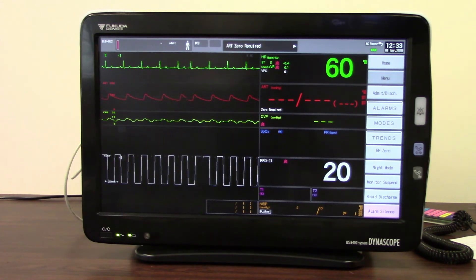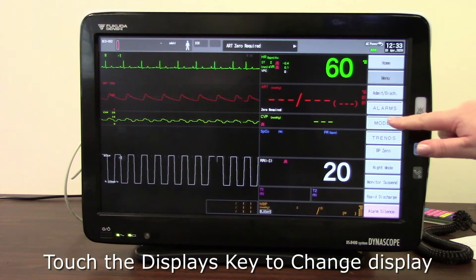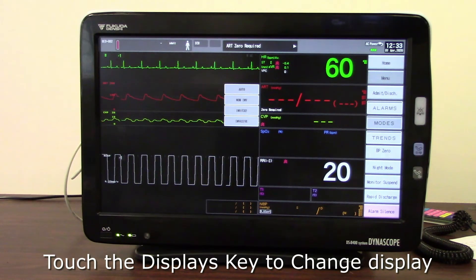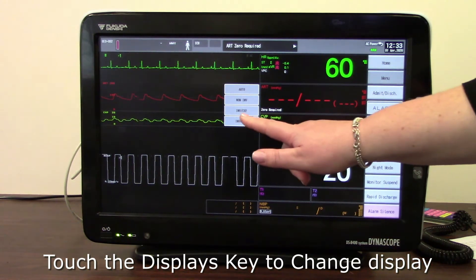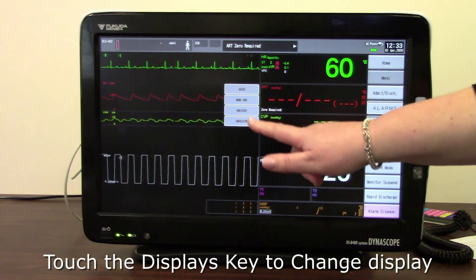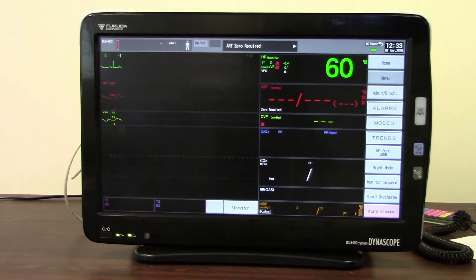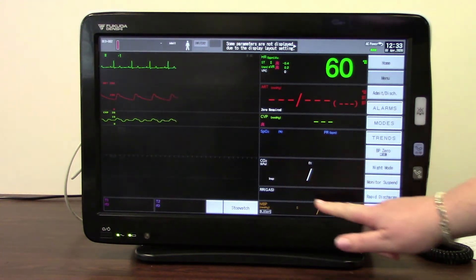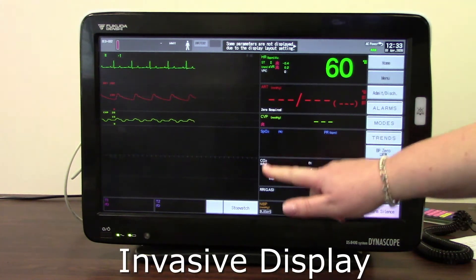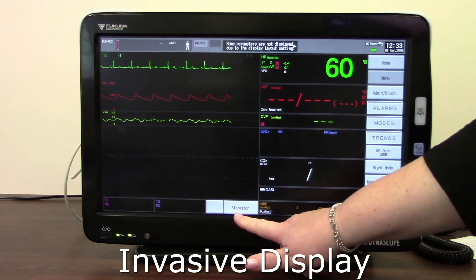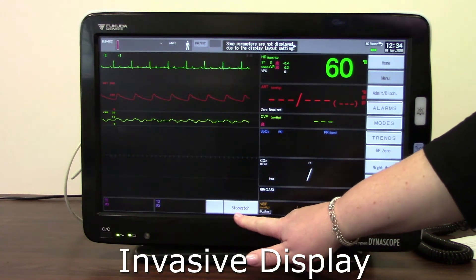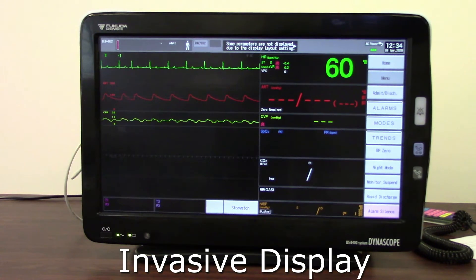To change between our various displays, if we just touch here, I can go into any of the others. I also have an invasive plus CO2 display, which now adds in my CO2 monitoring and also a stopwatch there. You'll see that's appeared, which was different.